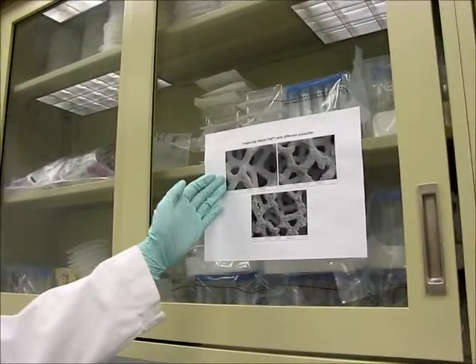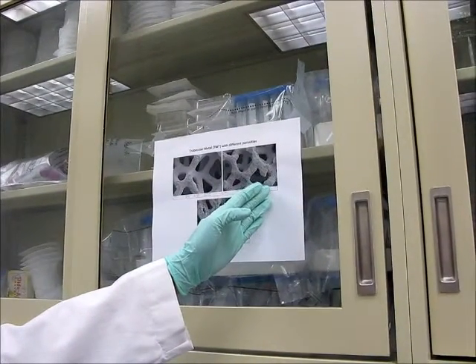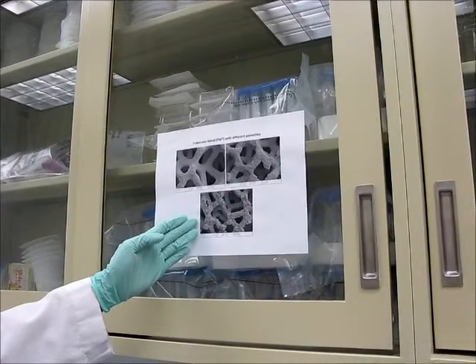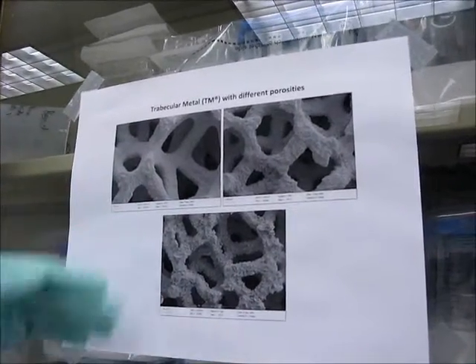This is 65 ppi, which means pores per inch. And we have 80 ppi TM, which is the material that is currently on the market. And we can also make TM 100 ppi materials. You can clearly see that these different materials have different pores and porosities.